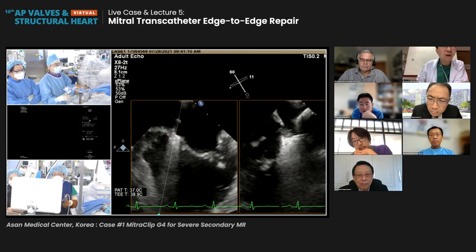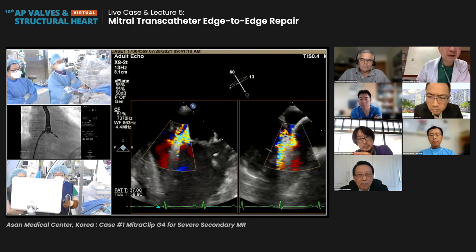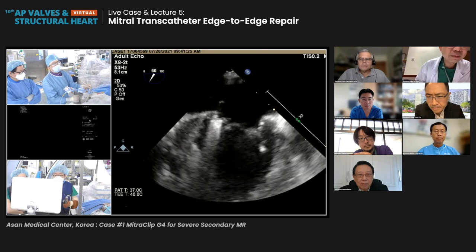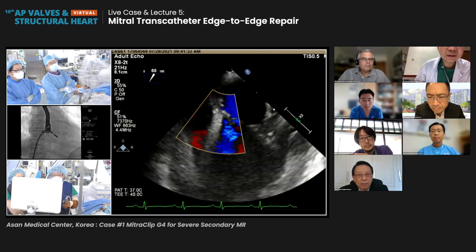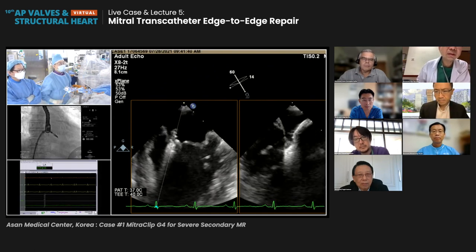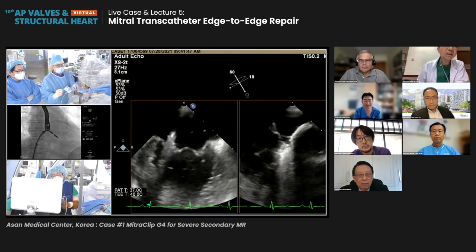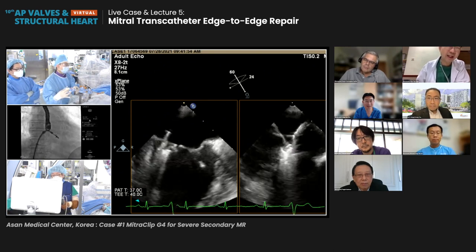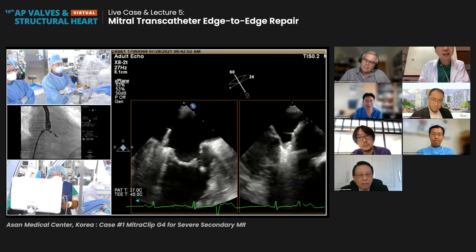Okay, 60. Hello, Dr. Kam. You know the G4 CDS has a side port for monitoring the LA pressure. Are you doing this in your lab? Do you find that monitoring helpful? Yes, I'm monitoring the LA pressure with the G4 system. Now I can see that the LA pressure is about 13. But if I have this kind of very stiff angulation of the clip delivery catheter, then the pressure monitoring is not accurate. It has damped pressure. You also find that not that helpful in many cases? Yeah, because sometimes there's very severe damping, and it is not a reflection of the actual LA pressure, especially if the catheter is being torqued excessively.